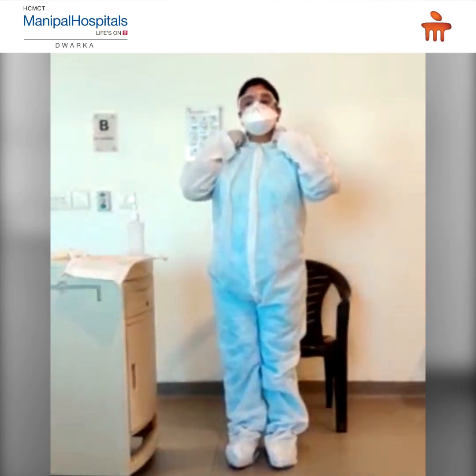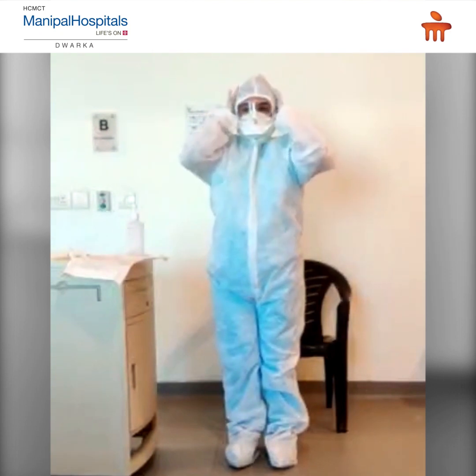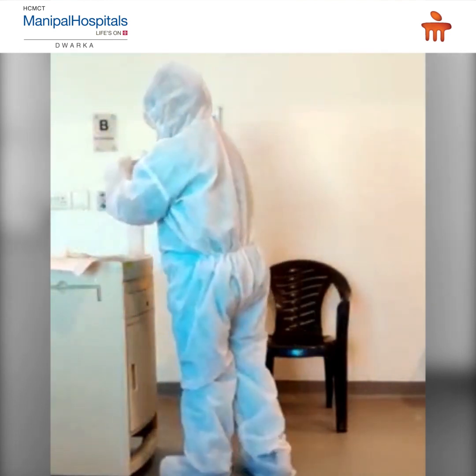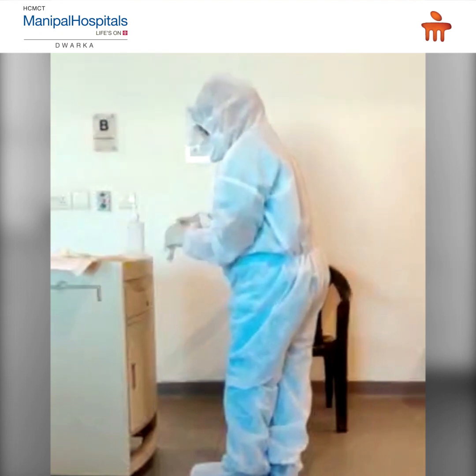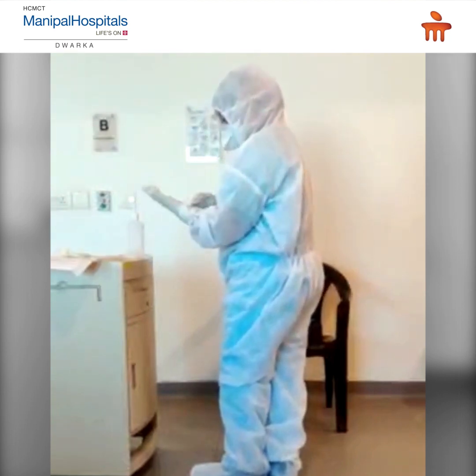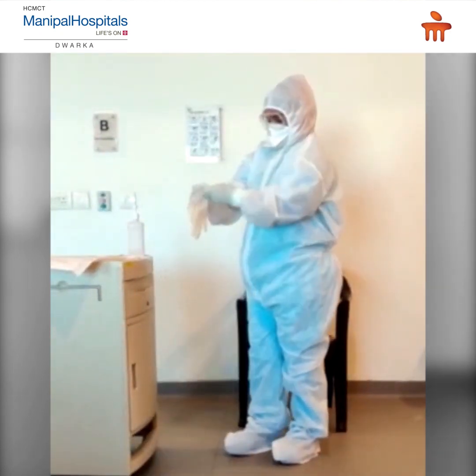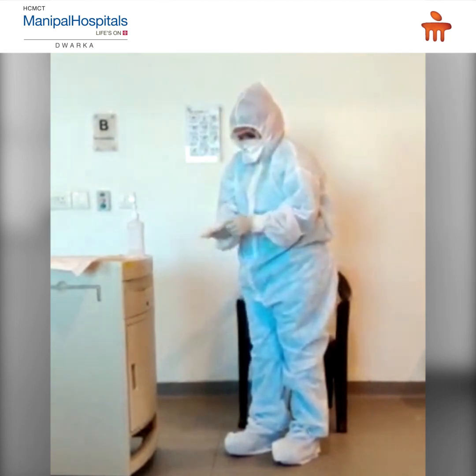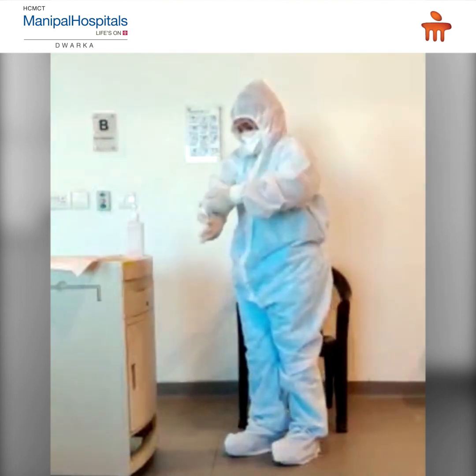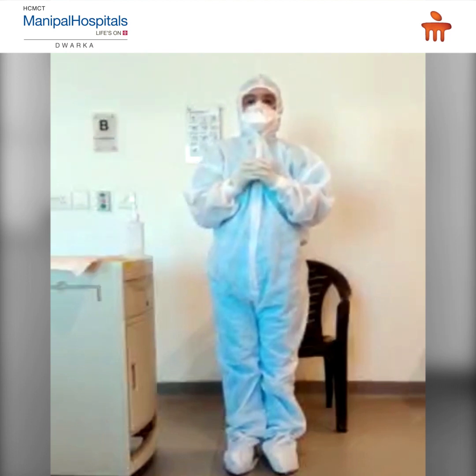Wear the hood coverings over the forehead and cheeks. Now use the second pair of gloves. Pull them to cover the sleeves and forearm as much as possible. Now you are ready to work and orient in the COVID-19 area.